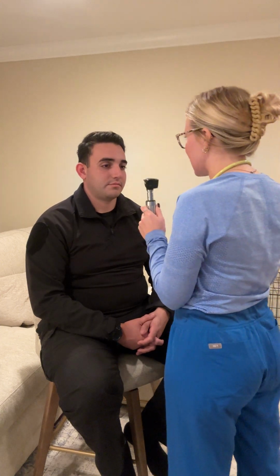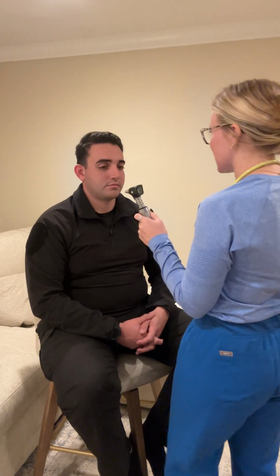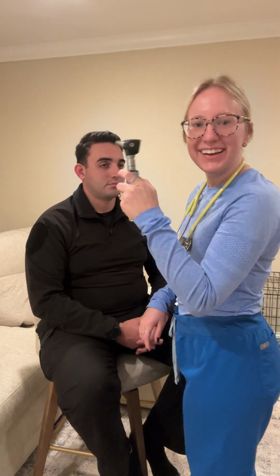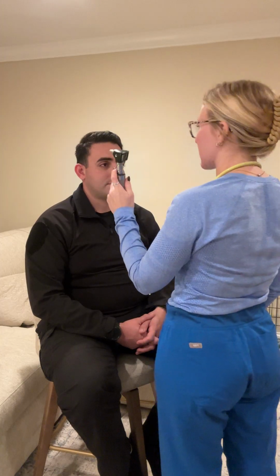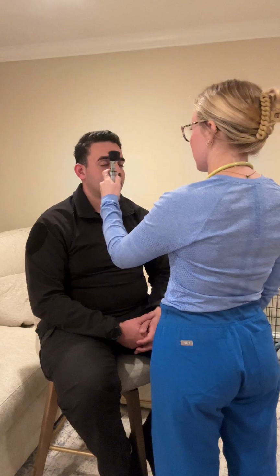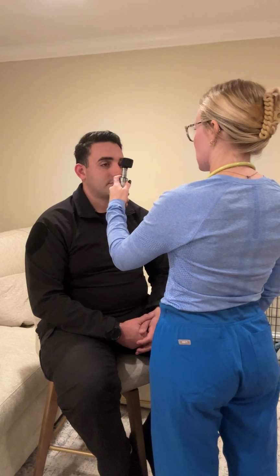So we are going to take our fundoscope and we are going to examine your eyes. This will test for PERRLA, which is accommodation of the eye with constricting to light. So I'm going to take this. I want you to stare straight ahead at me, okay? This thing, for the sake of the video, does not have a light working, but for the sake of the video, we're going to pretend it does have a light working. So just stare straight ahead at me. We're going to test for your pupils to constrict to light.